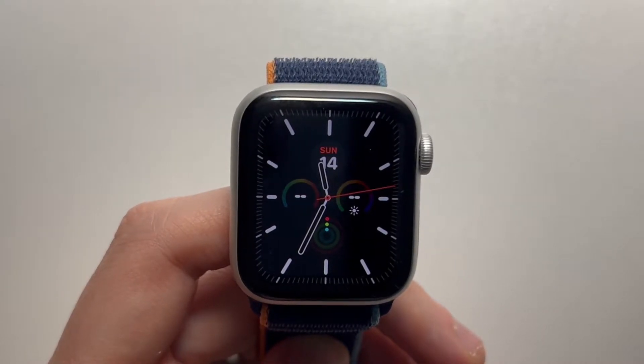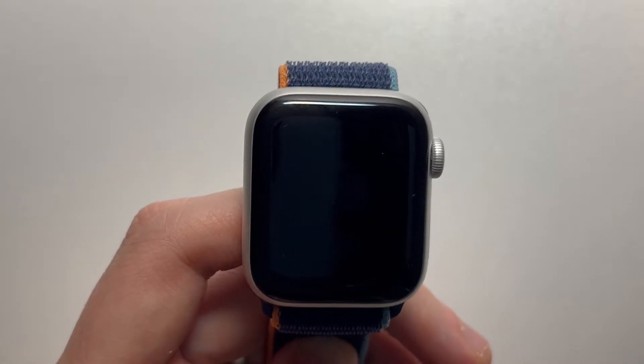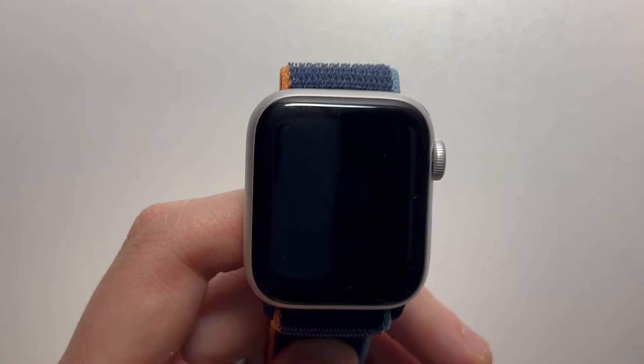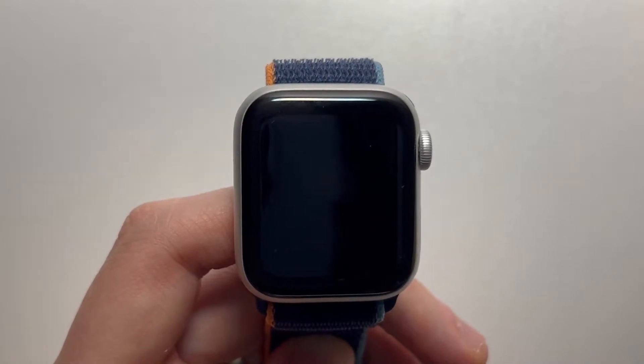Alright guys, so I'm going to show you how to turn on fall detection for your Apple Watch. This will explain it very quickly. So if you're wearing your watch and you fall over, it's going to start making a loud beeping sound, and it's going to give you a prompt on screen to call emergency services.